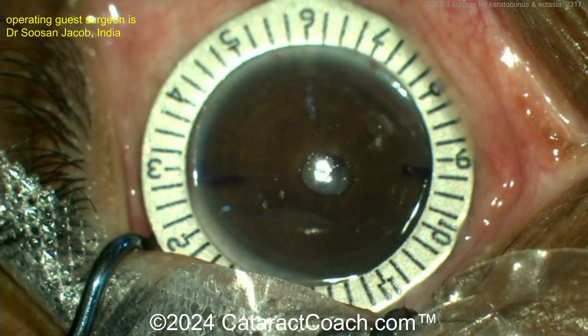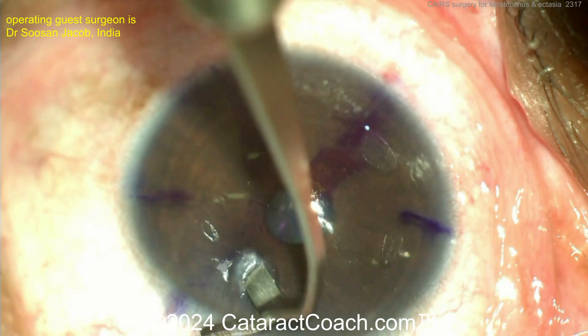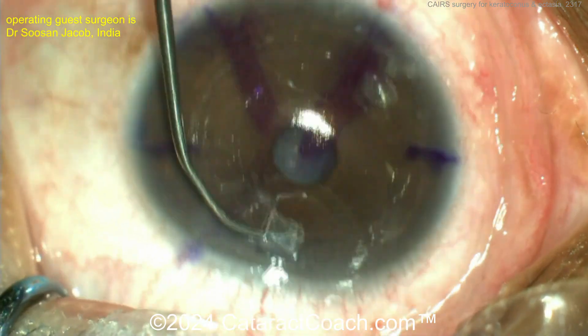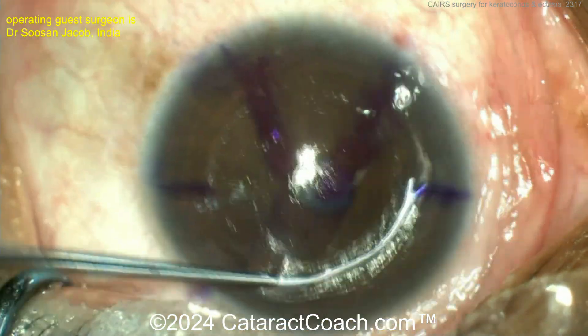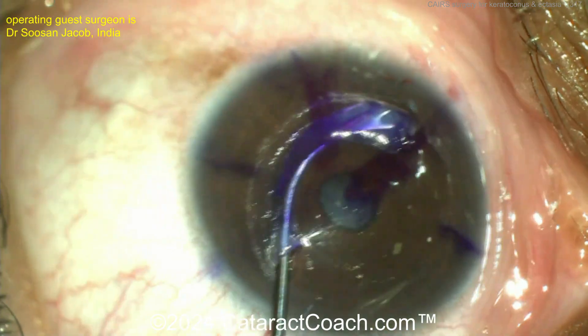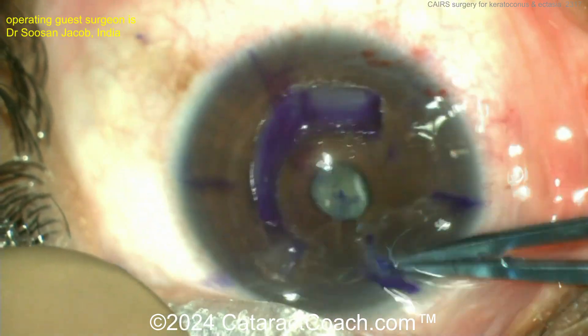Starting off with some marks on the cornea, then centering up at the center of the pupil and getting the orientation appropriate. Here is the path that you're making — you can make this path with a femtosecond laser or do it manually. Then here it is with a Y-shaped curved hook to deliver that graft. And you can see by looking at the reflection of the rings, it's a lot better looking.